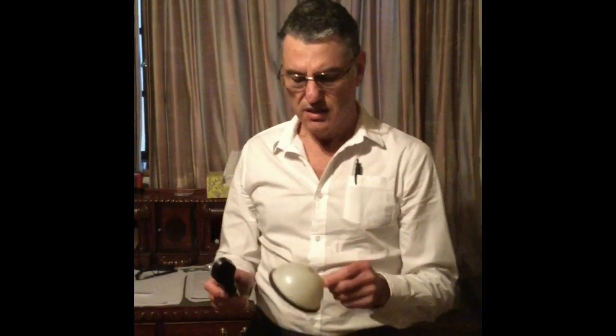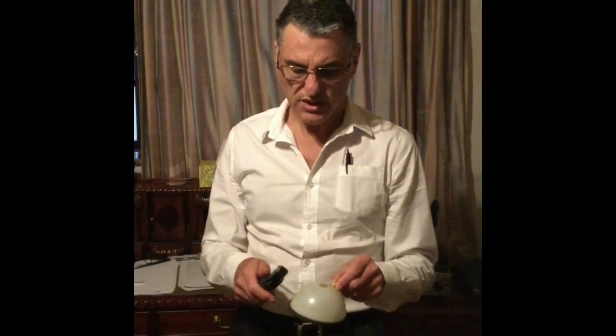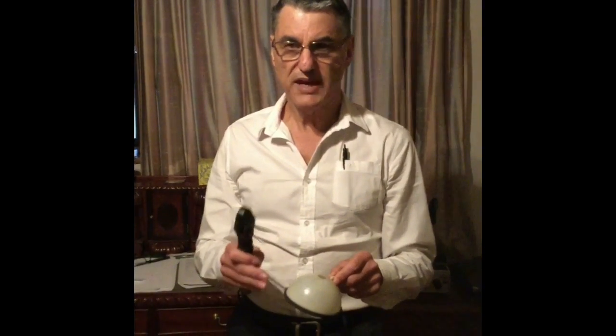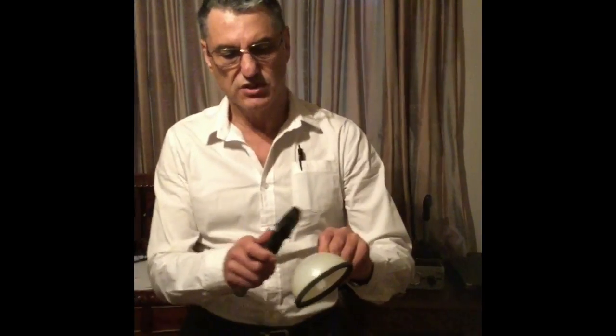This is the Novosphere. It's designed to do a quick visual field screen on patients and is designed to replace the confrontation test, which is pretty unreliable. You simply put this on the patient's face, shine a light, and ask the patient if they can see it in the various different positions of gaze.